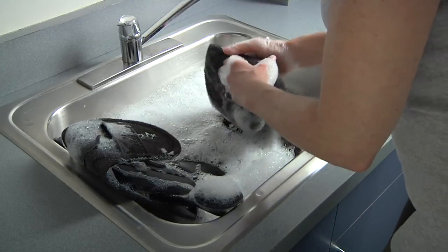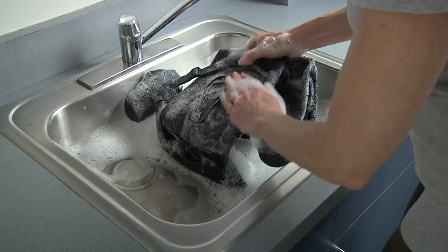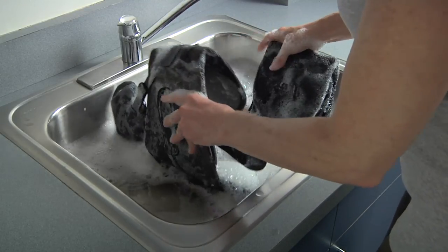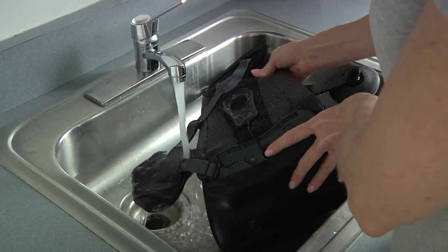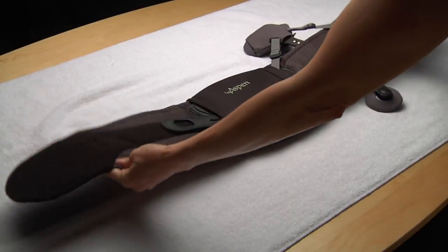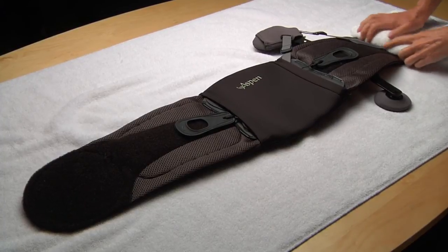When desirable, the brace can be washed using mild soap and water. Do not use bleach, harsh chemicals, or machine wash. Rinse thoroughly. Pat out any excessive moisture and allow to air dry completely. Do not machine dry.